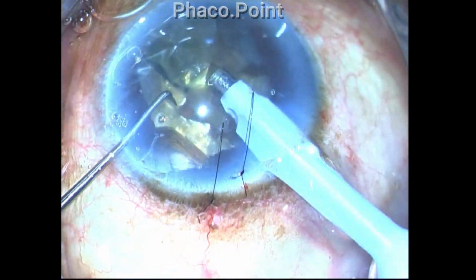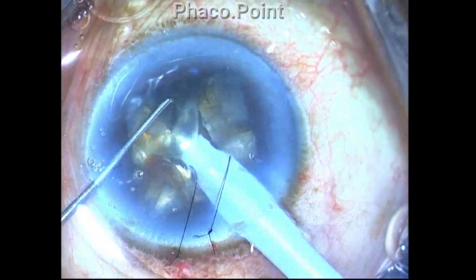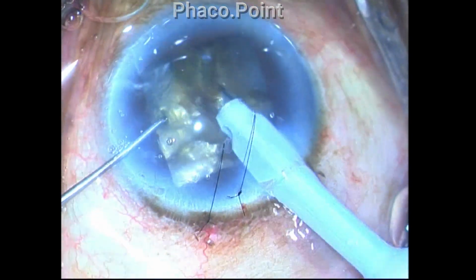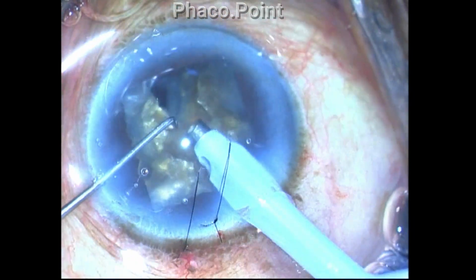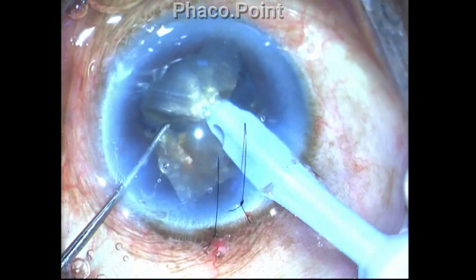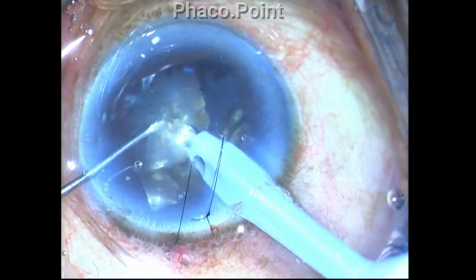So I go ahead with the phacoemulsification using the direct phaco chop maneuver. I try to stay as far in the periphery as possible, going against the principle that you have to bring the pieces to the safe zone for emulsification. I try to emulsify it somewhere in the inferior periphery itself, so as not to cause the Descemet membrane to redetach.